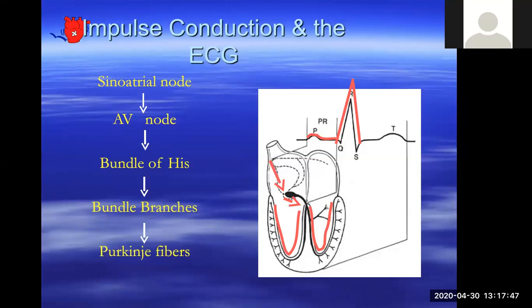And if you have a lead, again an electrode, at the bottom, it will all look positive, big waves, which is the R wave that you see here. But just a quick reminder about this Q wave, which you see even in those leads: the electricity in the ventricle is produced predominantly by the left ventricle, because it is bigger and much thicker than the right ventricle. And the septum, which is part of the left ventricle, not part of the right ventricle, is actually stimulated from left to right.